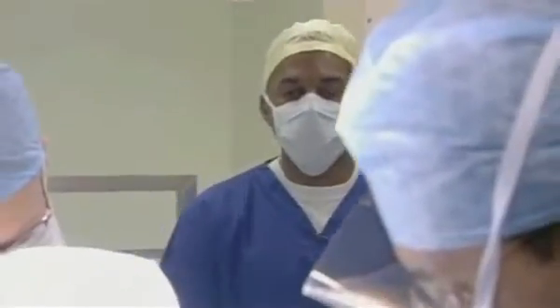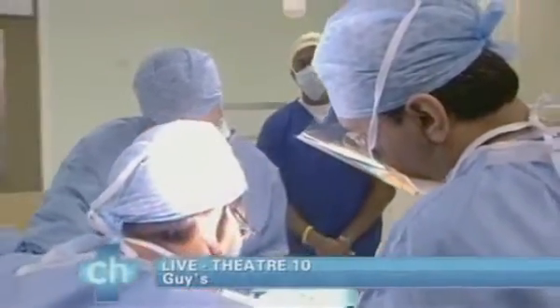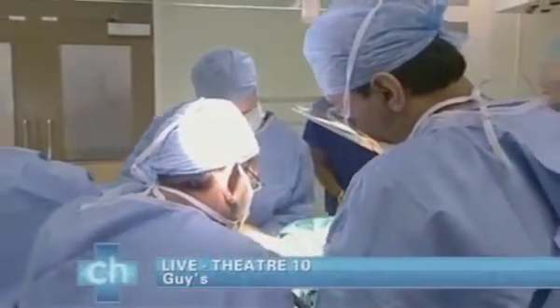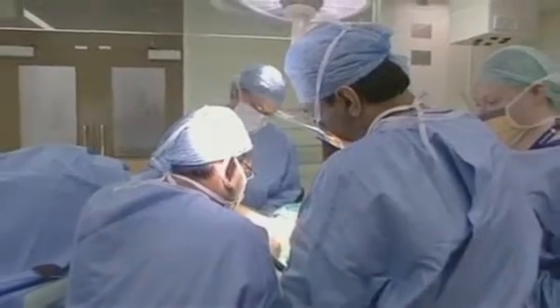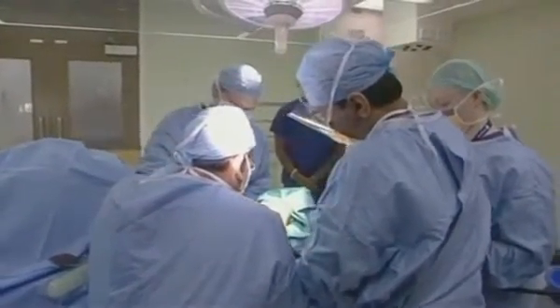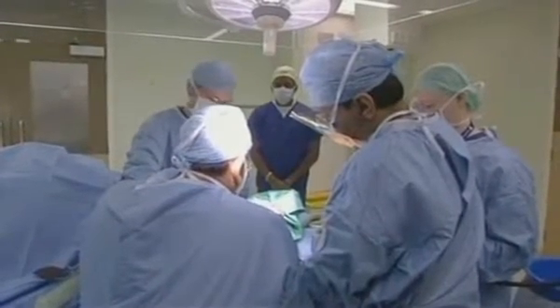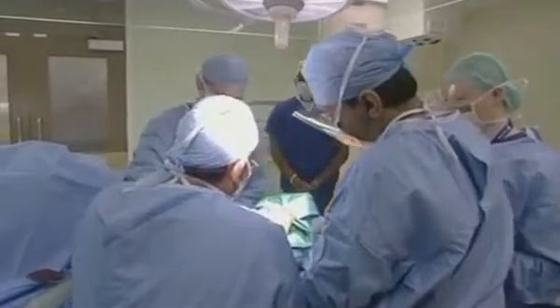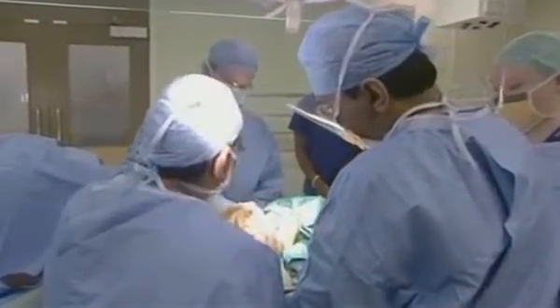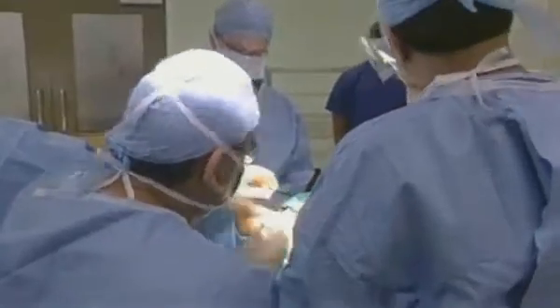Thanks, Nadia. The noise you can hear is a very small saw that Mr. Sam Singh is using on Steve's ankle. Steve has had sprained ankles for the last 7 years. So you sound like you're stopping there, Mr. Singh. Yeah, I've just about finished the cut. So I'm making the bony trough, which I'm now going to push in and make the groove, therefore, deeper. So we've just finished making the trough.